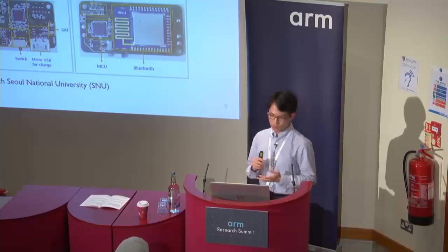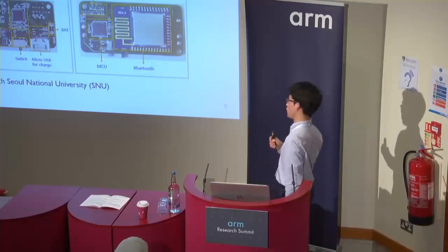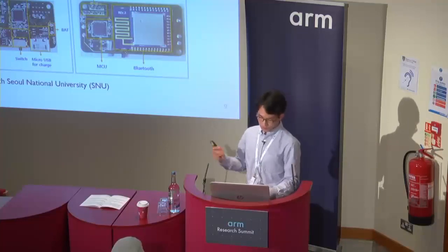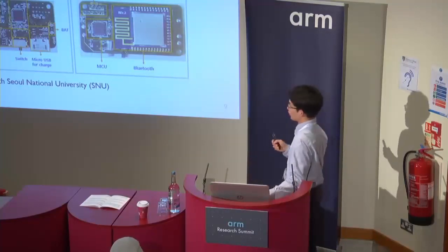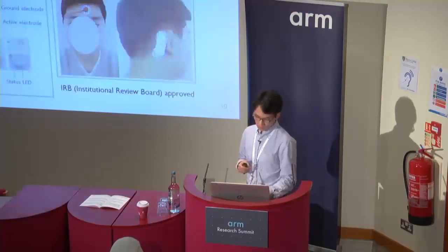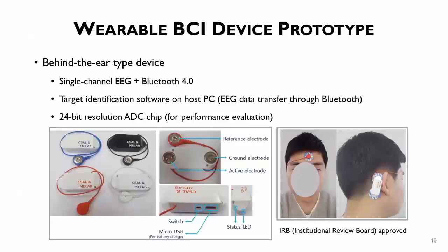The device consists of a 24-bit resolution ADC chip for performance evaluation. As you can see, the printed circuit board has a small form factor, comparable to a coin. We can attach it behind the ear like this. And this device has institutional review board approval in South Korea.